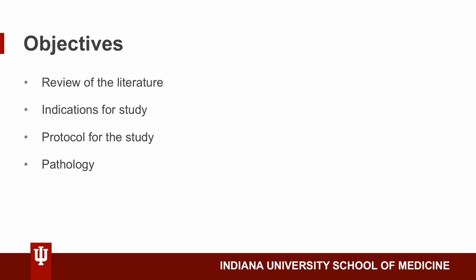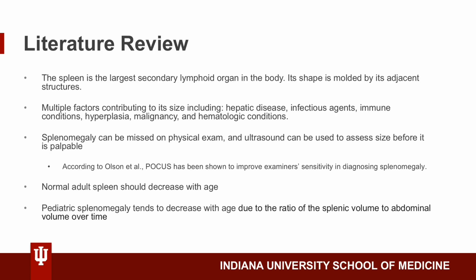So what we'll review in this PowerPoint is we'll talk about the literature, indications for scanning a spleen, the protocol for the study, and some pathology. Okay, so we'll go ahead and start with our literature review.